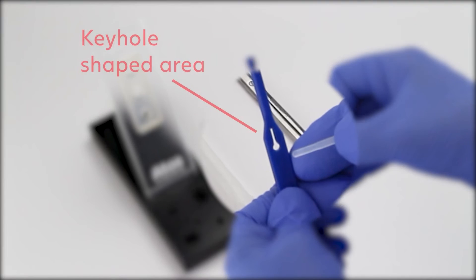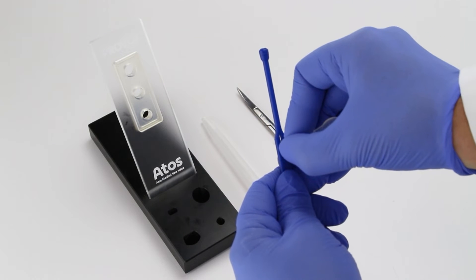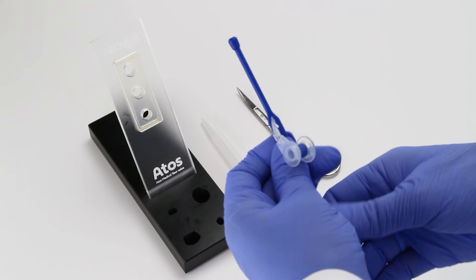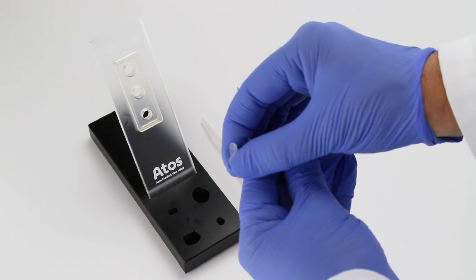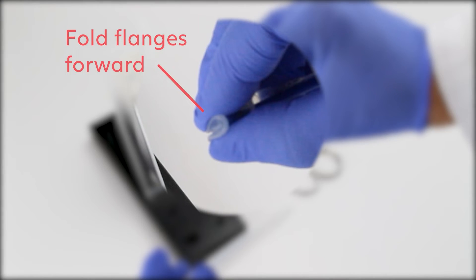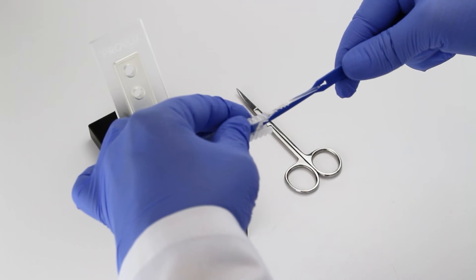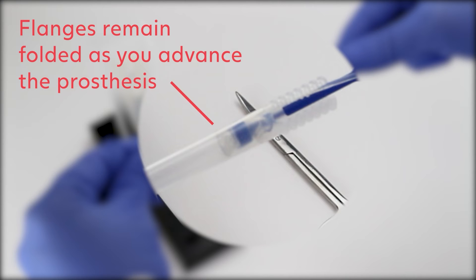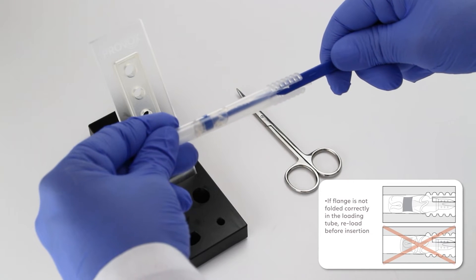Thread the safety strap of the active valve into the keyhole shaped area of the inserter pin. Pull it into the narrower part of the slit to lock into place. Place the active valve on top of the inserter pin. Fold the esophageal flange forward by pinching it together like a taco. Hold the loading tube with your other hand and insert the esophageal flange into the opening in the tube. It is important to keep flanges folded forward as you advance the prosthesis in the clear loading tube.